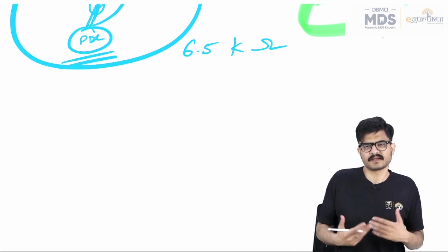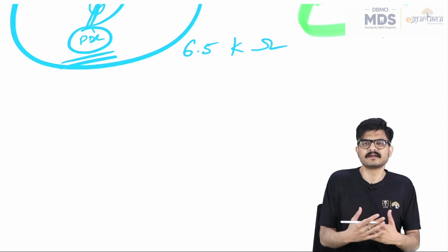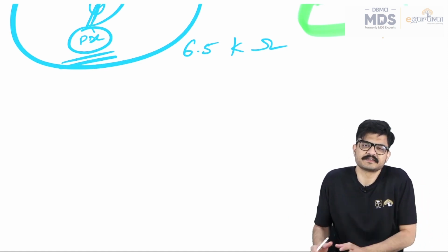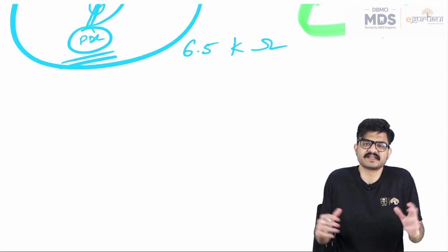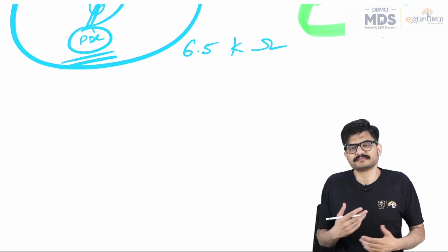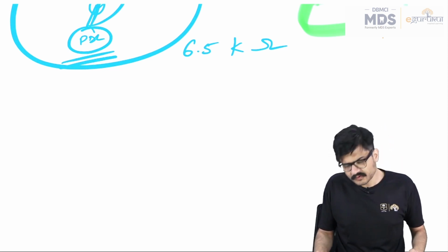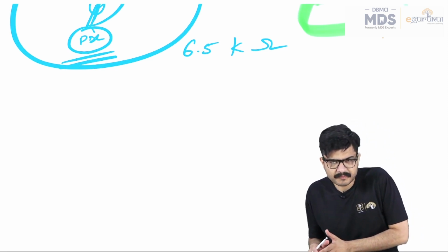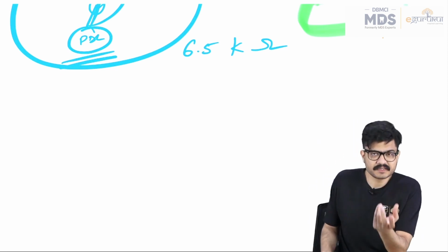The electric circuit gets completed prematurely, and you get that beep signifying that 6.5 kilo ohm resistance has been reached, right? And the electric current had started at that value. So you get false readings. So people started employing alternating current at a particular frequency.